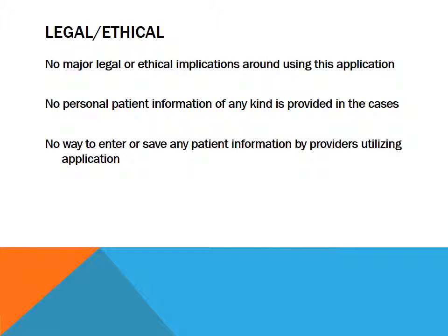There are really no legal or ethical implications surrounding this application or the use of it. The cases it utilizes to teach users contain no personal patient or identifying information that could in any way violate privacy rules. And the application itself contains no way to enter or save any information regarding patients within it. It is therefore very safe to use in a clinical setting or outside.